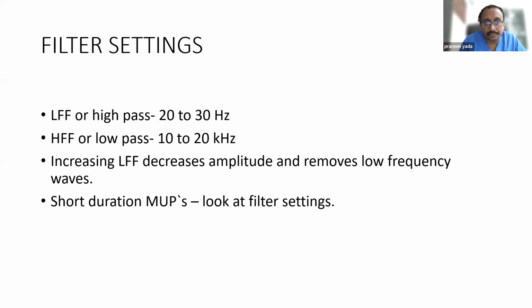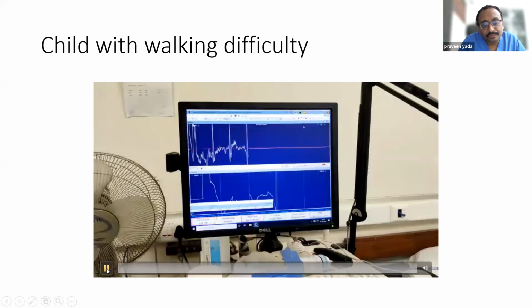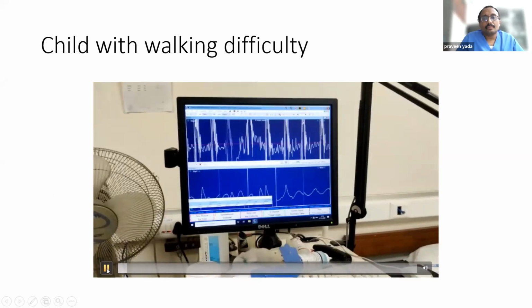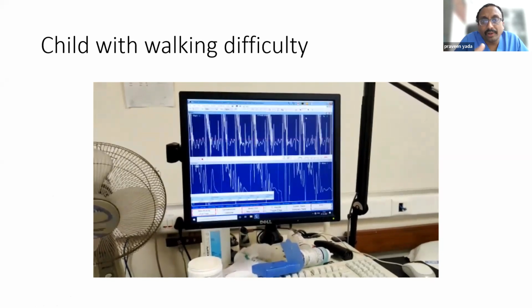Now, coming to the case I had presented, this is the EMG of the patient, and yes, the CPK was about 200, and this is the EMG. See it and try to tell me what the diagnosis is. This is spontaneous activity.